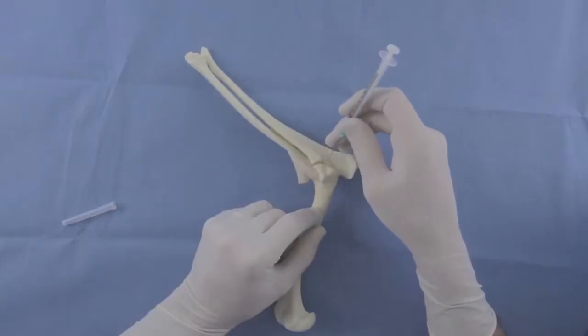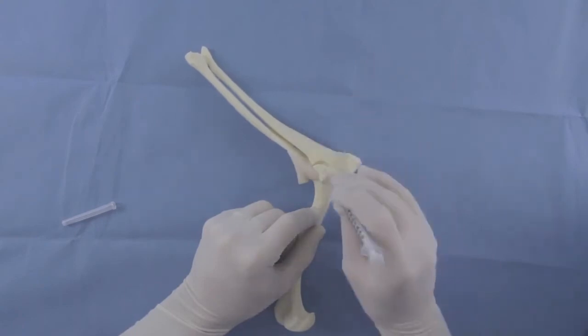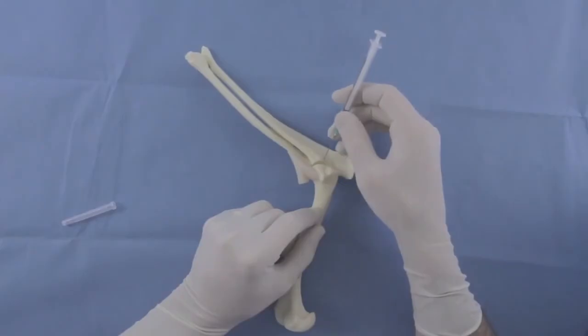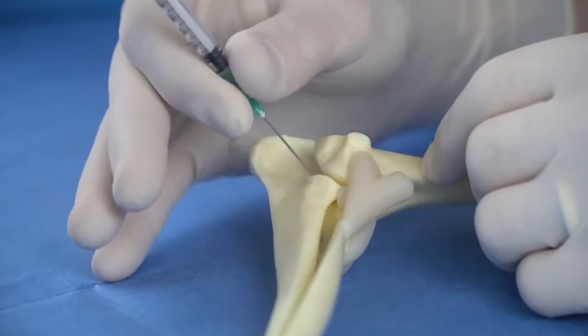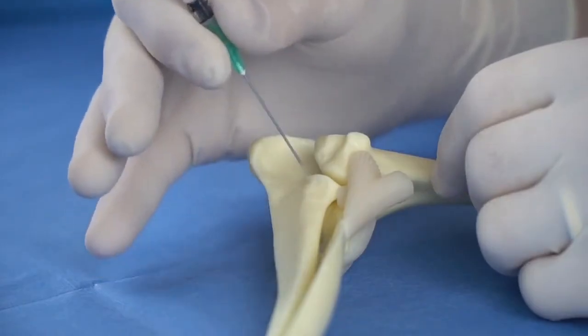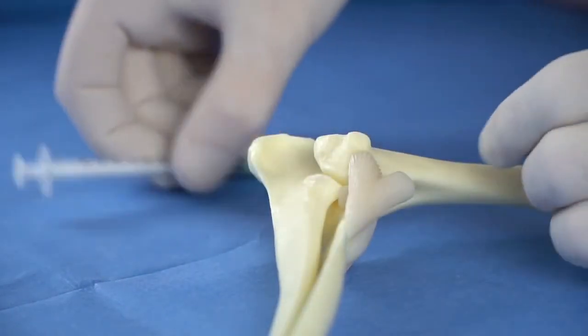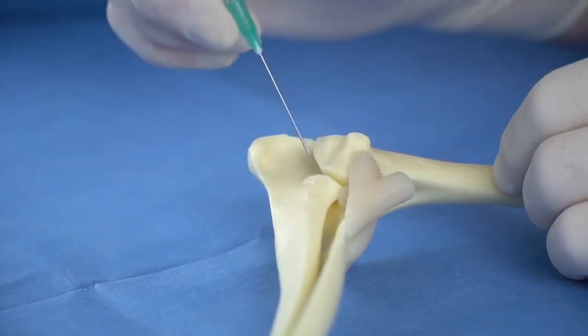Add approximately three to four millimeters to this distance, then insert your needle and angle the tip towards the epicondyle. Walk the tip of the needle one millimeter at a time until it falls into the joint space. If you are in the correct window, there is nowhere else for the needle to fall into other than the joint space.